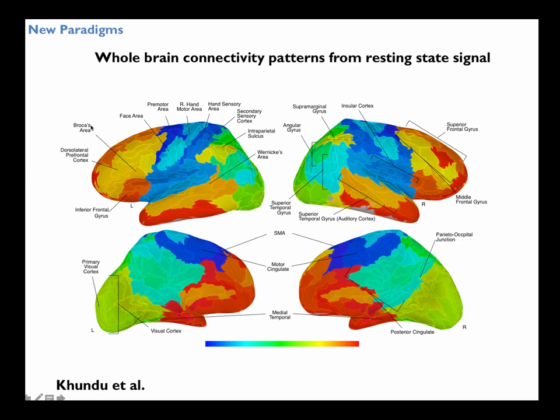This happens to be an average of 7 subjects, but we're at the point now where we're beginning to parcellate individual subjects. And this brings to mind one interesting point, which is that coming up with universal parcellation schemes for subjects is difficult. So each subject has their own parcellation, and maybe the distribution of these parcellations is a biomarker in itself. But if you want to start averaging together subjects' connectivities, it's efficient to first parcellate, but then you want to make sure that you get similar parcels across subjects. And that's tricky. There's work on that being done right now.